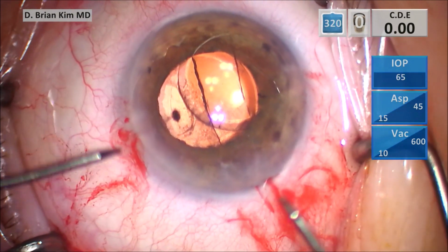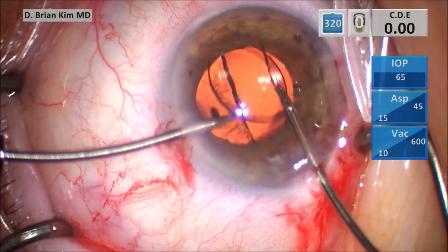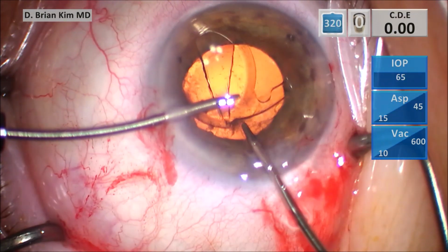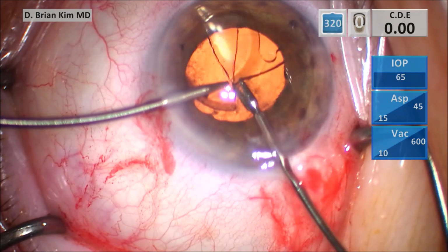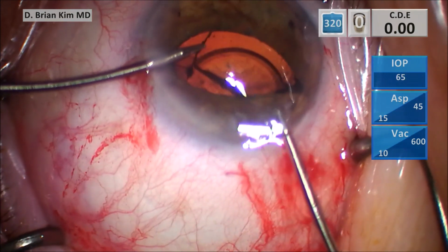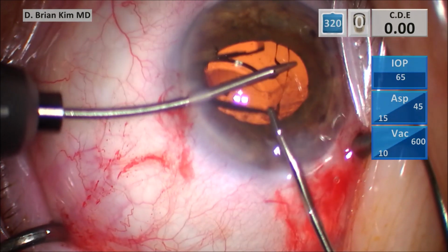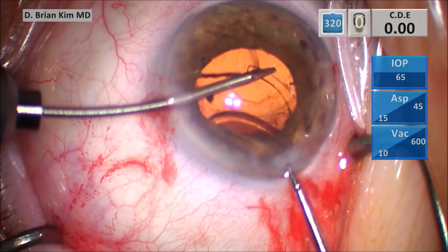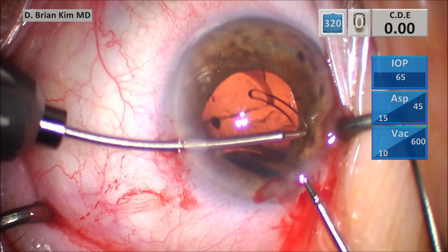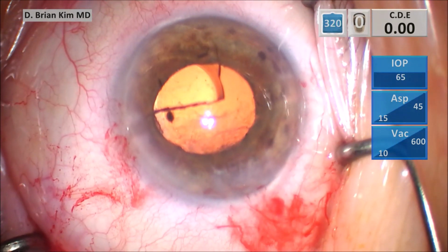Very carefully take each piece out. I like to go after the right side piece because, as you can see, as I pull the cut edge, it will cause the haptic to collapse on itself. So with the two-handed technique, push that left side piece away, grab the cut corner, and as I pull it out of the wound, the lens and the haptic will collapse. I'm using the left side forceps to shield the corneal endothelium as the lens collapses through the incision.